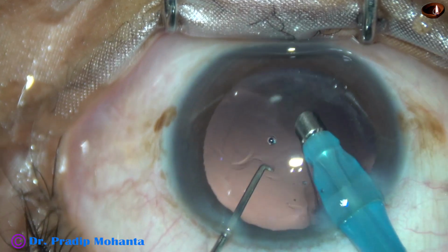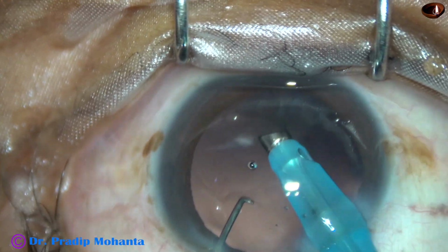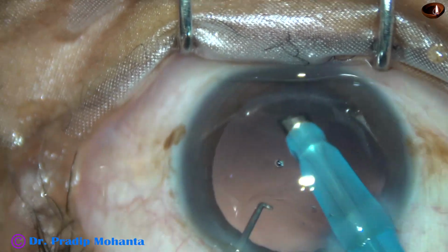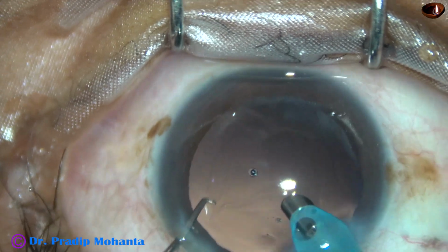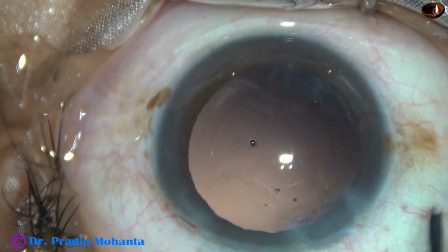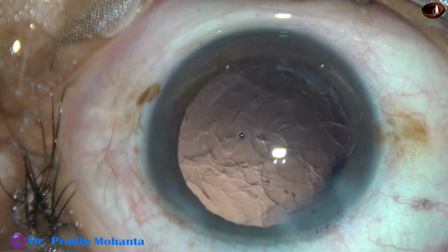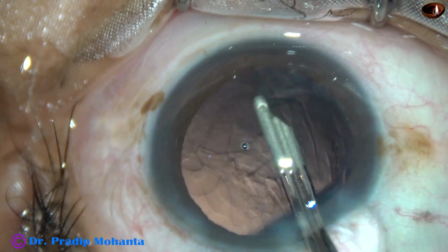So the most difficult part is done easily, but here some cortex is there at 6 o'clock which I was afraid to aspirate. So what I am going to do is inject some visco and use a 23G Simcoe to remove this cortex.